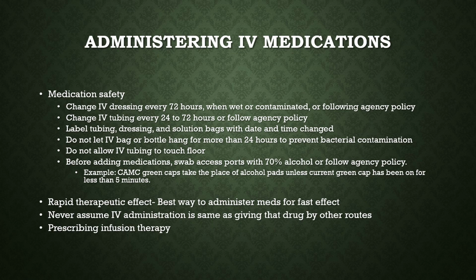So usually, you want to follow your institutional policy wherever you work. The policy may differ somewhat from institution to institution, so you want to follow the policy of the hospital where you work. When this PowerPoint was created, there may be some very small changes, but for the most part, this follows CAMC's policy. Change the IV dressing, and the dressing is what's over the IV site. The clear bio-occlusive dressing and the tape are all supposed to be changed per policy every 72 hours, or if it becomes wet or contaminated. Now, you want to be very cautious with that.